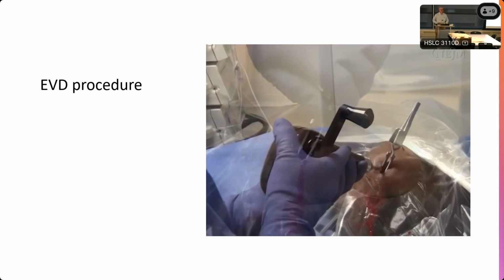Okay, let's get to the drilling though. First of all, what about the depth stop? We just got these power drills now that are fully equipped, so we don't have any twist drills. Doesn't work, bring back the hand drill. I'm joking.